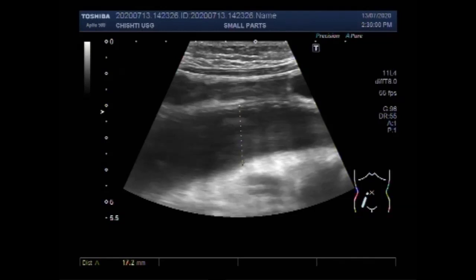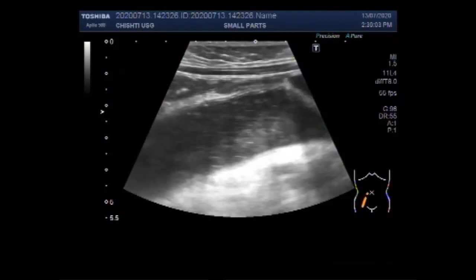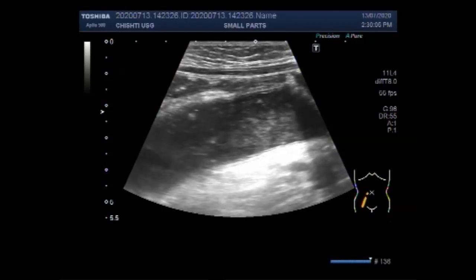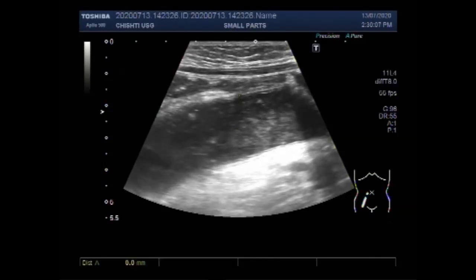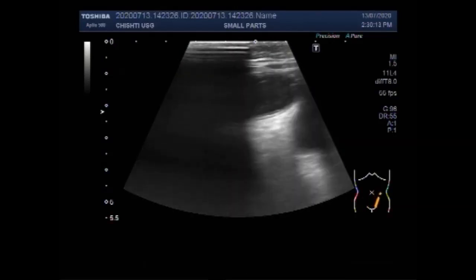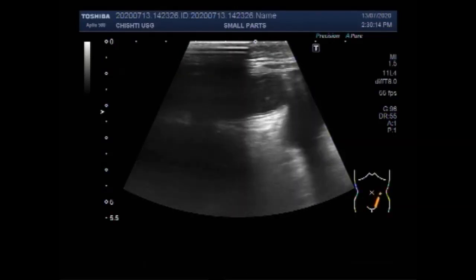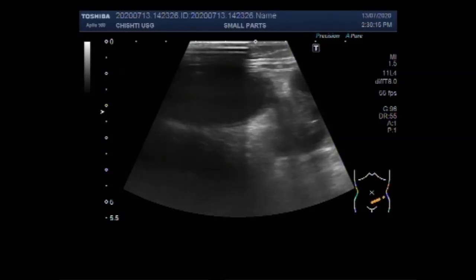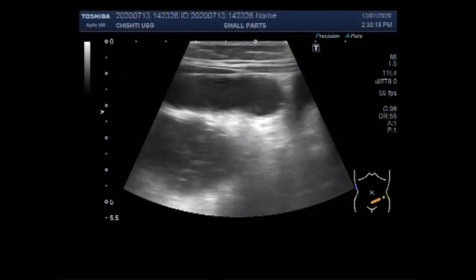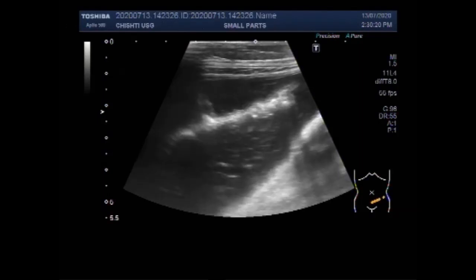Again, you can see the measurement is about 1.7 cm and the patient is about 3 years old. So the gut loops are grossly dilated.